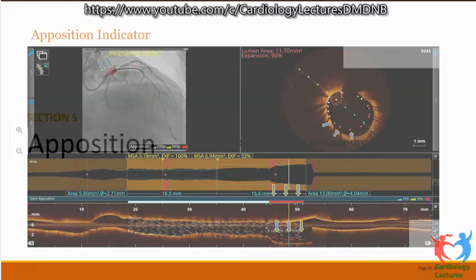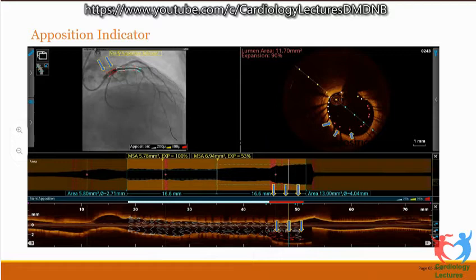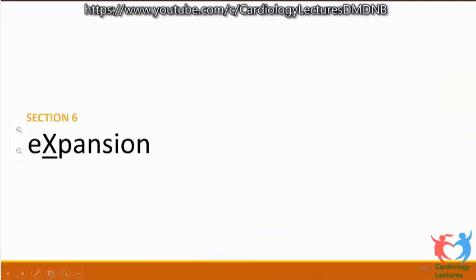There were no dissections noted. Now we come to the apposition indicator, which shows you that in the left main part, the stent is probably under-expanded and not well apposed. These are the red dots. These arrows indicate that these are not well apposed here. And you get it in the profile. This tells you that the stent is not well apposed. So we needed to go further.